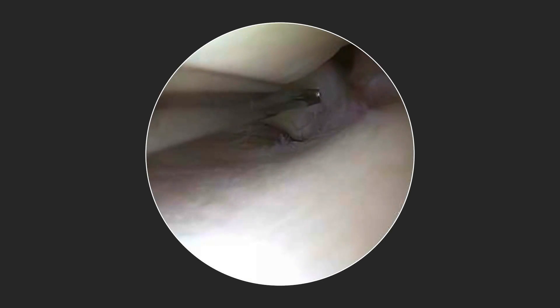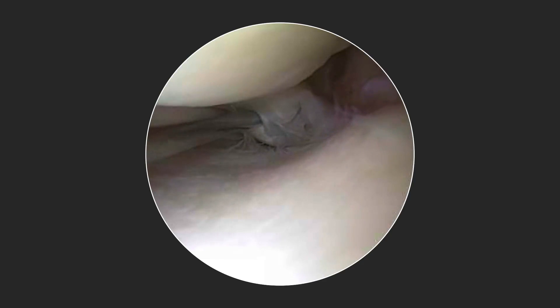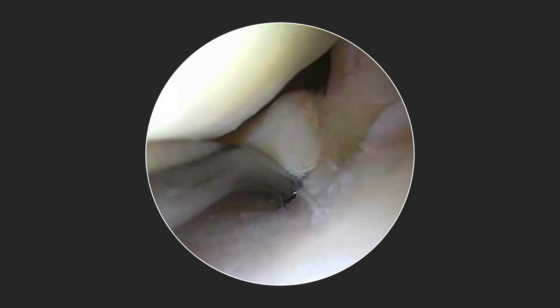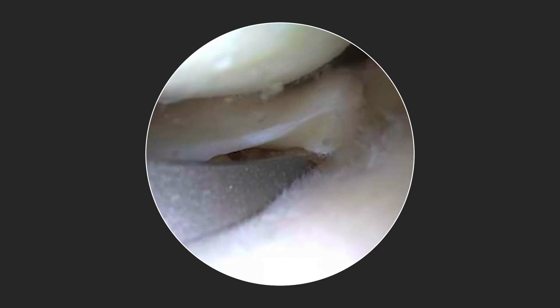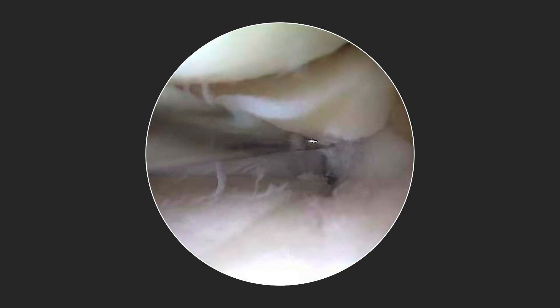Back to our surgical case — here is our meniscus root tear off of the posterior medial meniscus root. The root is unstable and requires repair. I typically utilize a small curette to create a small bony bleeding bed for anatomic repair. We then utilize the Arthrex point-to-point meniscal repair guide, which allows placement of our 2.4 millimeter pin in the exact correct position to create an anatomic repair. Once the drill is confirmed in the correct position, a wire is passed through the drill cannula for passage of our SutureLock implant, which is then passed in a proximal to distal direction into the drill tunnel.